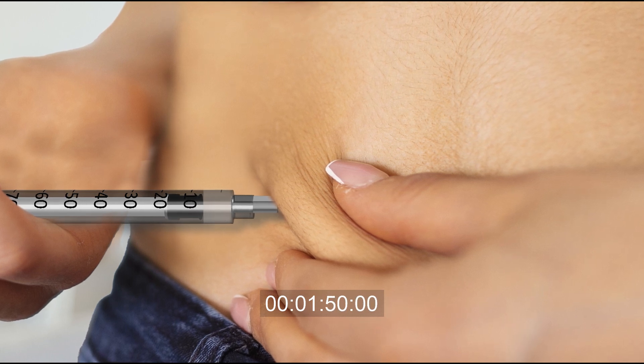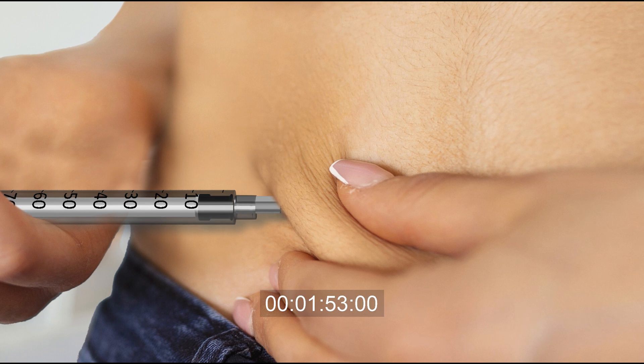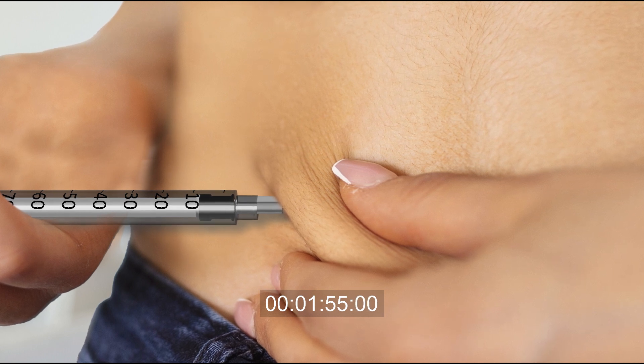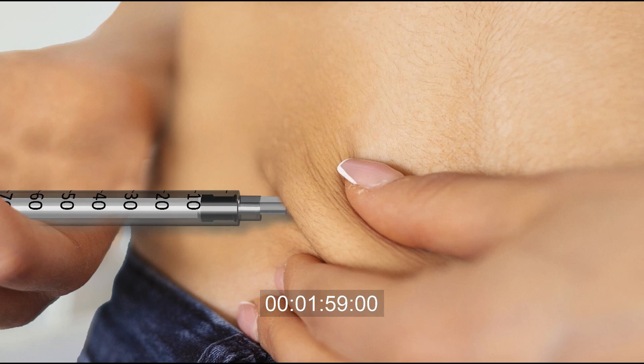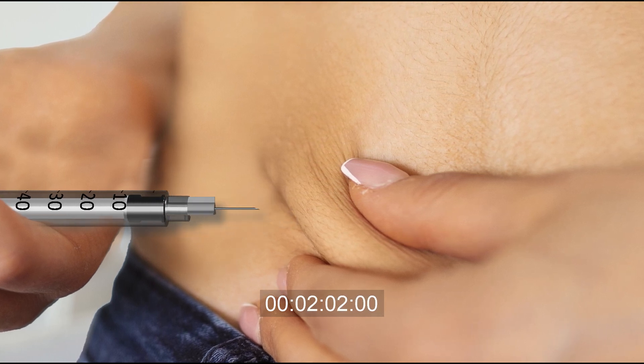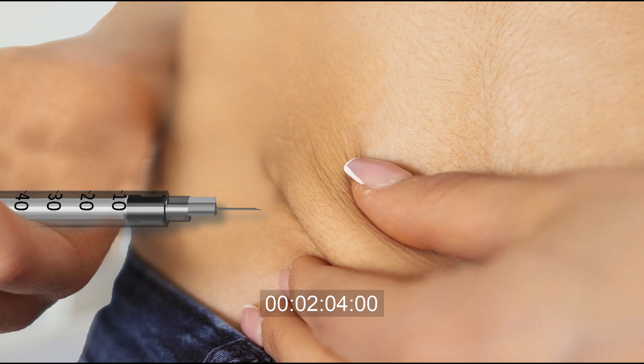Push the plunger at moderate and steady pace until insulin is fully injected. Keep the needle in your skin for 5 seconds. Remove the needle at the same 90 degree angle as it was inserted.